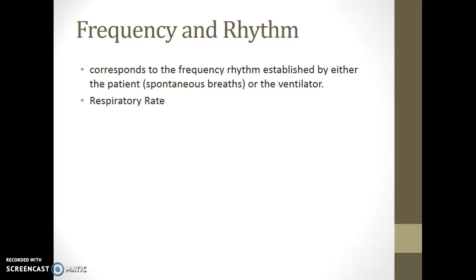Frequency and rhythm correspond to the frequency and rhythm established by either the patient, if they're spontaneously breathing, or the respiratory rate that we have set on the ventilator. So another way of saying frequency and rhythm is respiratory rate.